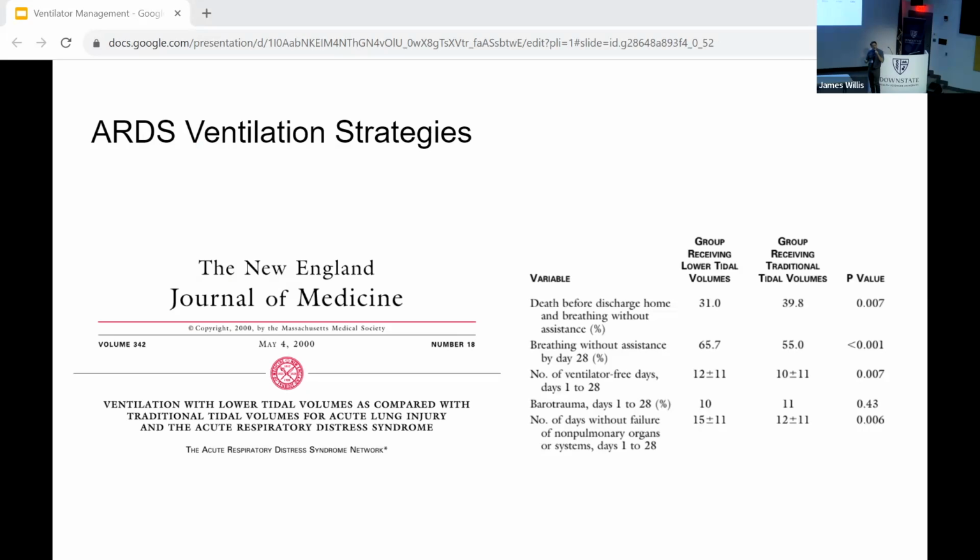And really, this is a landmark trial in critical care and emergency medicine about ventilating at low lung volume as compared to high tidal volumes. And again, going to the key crux here, when I emphasize that it's a syndrome and we're really trying to prevent ventilator-induced lung injury, one of the criticisms of this is perhaps what we were doing is not necessarily saving lives, but avoiding death. So by avoiding higher tidal volumes of 12 mLs per kilogram and above, maybe we're just preventing harm rather than saving lives. So really, maybe this is a trial of avoiding ventilator-induced lung injury, one criticism.